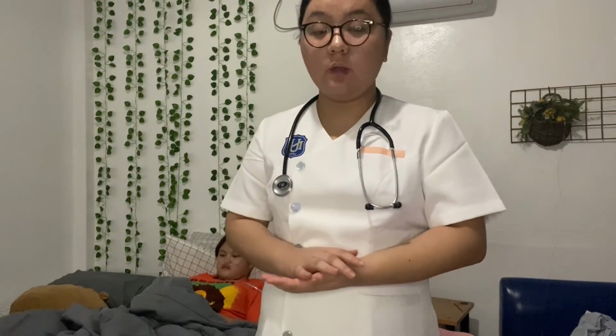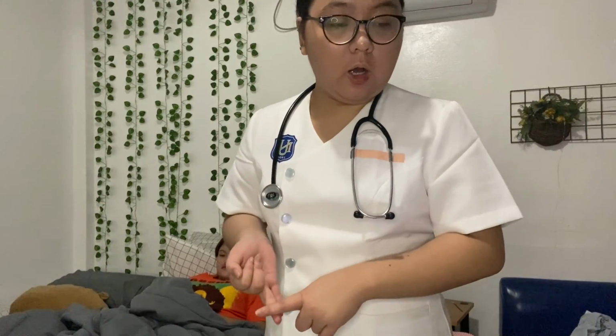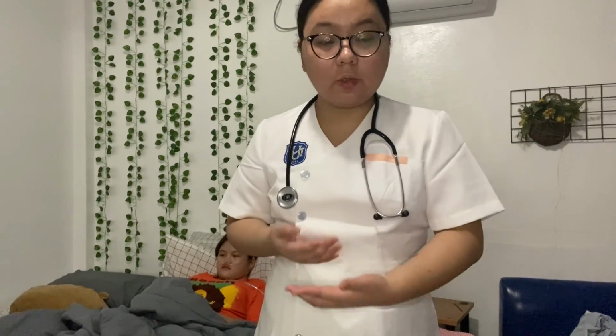So for the evaluation, of course, you need to record the following: respiratory assessment before and after the suctioning, size of the catheter used, amount of negative suction pressure, and duration of suctioning period. And also the route used to suction, odor, amount, color, consistency of secretions, frequency of suctioning, and patient's tolerance of procedure.